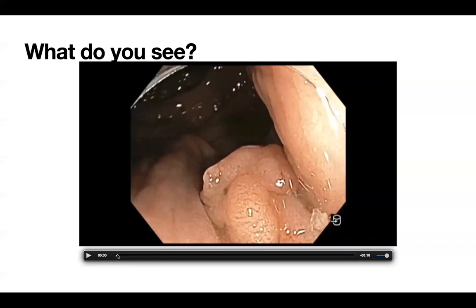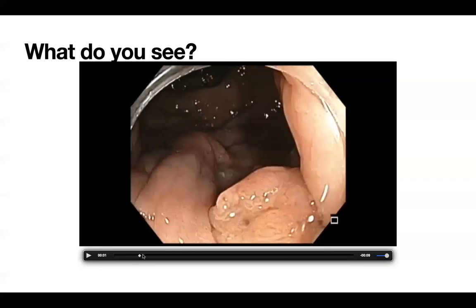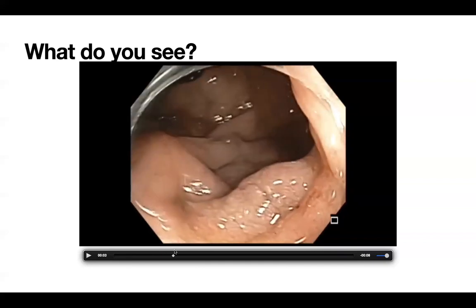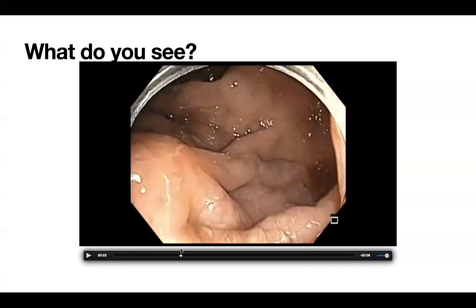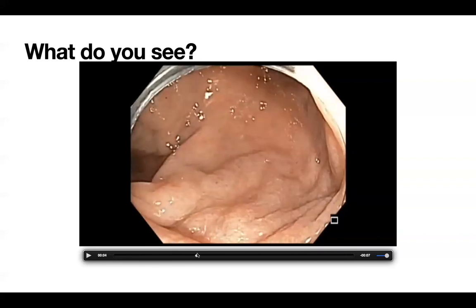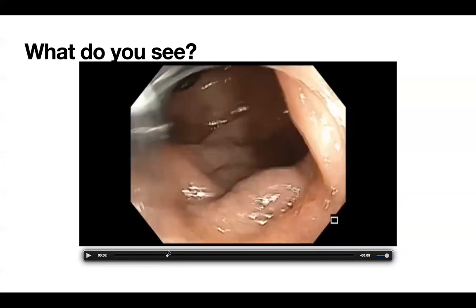And the concern that the endoscopist outside felt was this rough area surrounding this. You see this rough area here compared to the lining here? Yes, exactly. That was the concern, right? The mucosa looks a little bit different. And let me ask Roy and Sriram to comment on that.